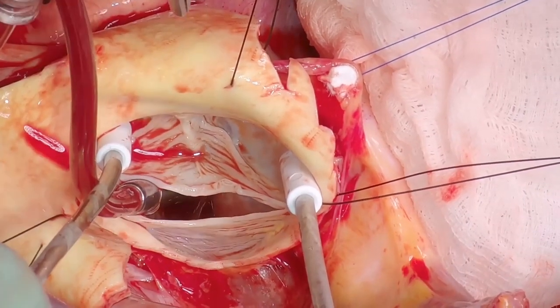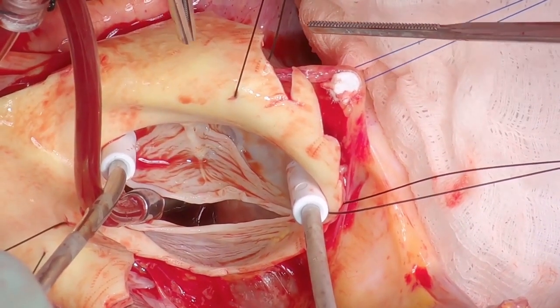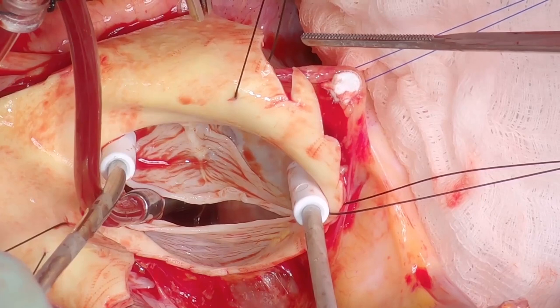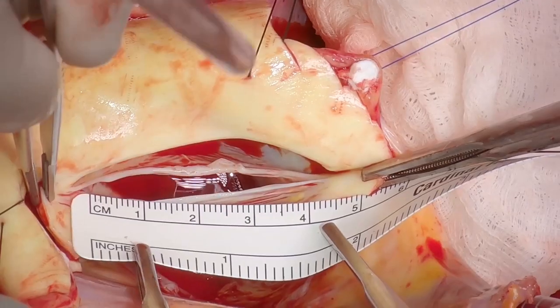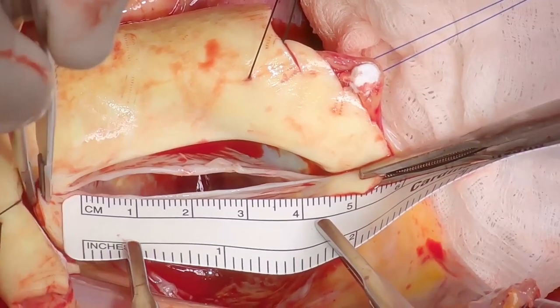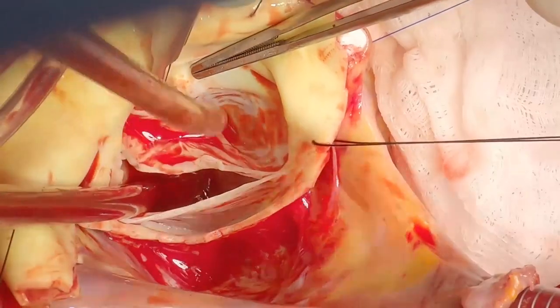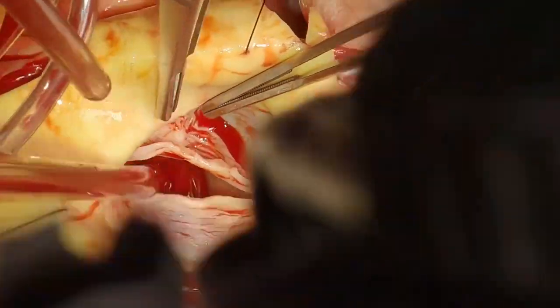Retrograde cardioplegia is kept available on these patients. One of the first steps is to free up and excise the raphe as much as possible. Here we're measuring the length of the leaflets — inevitably you'll end up using the largest graft possible, whether that's a 34 or a 38.